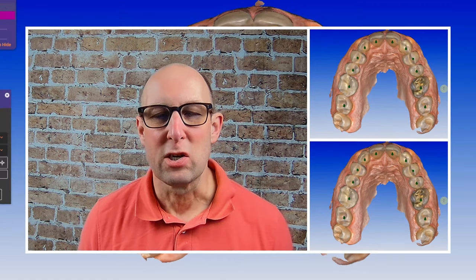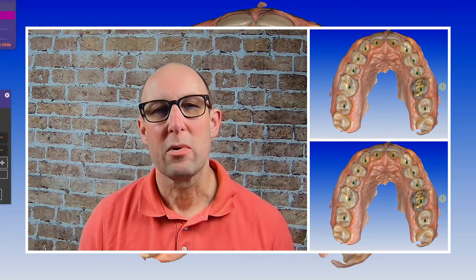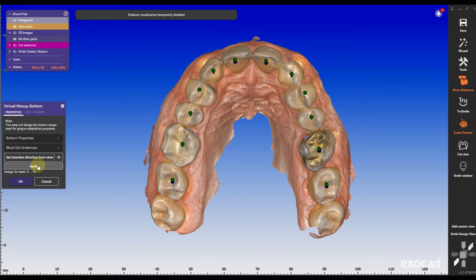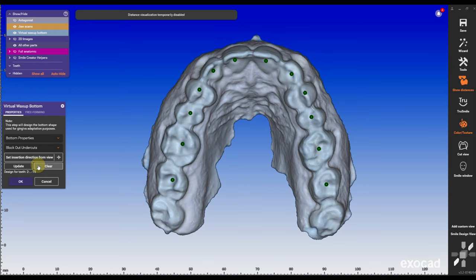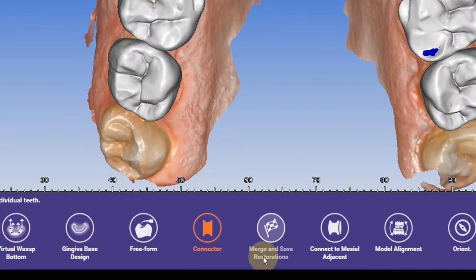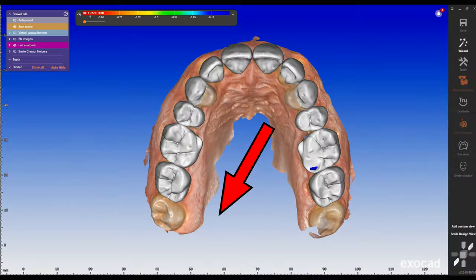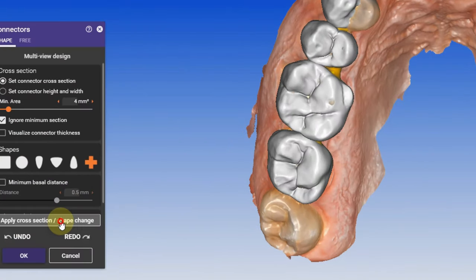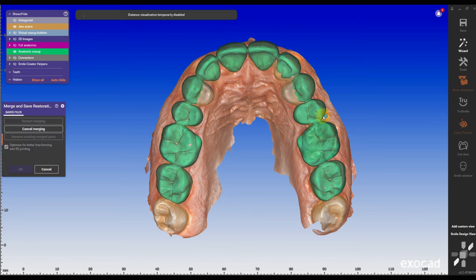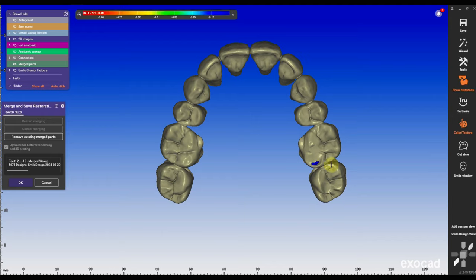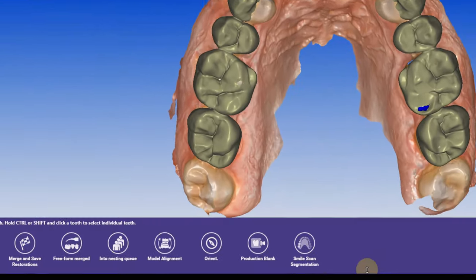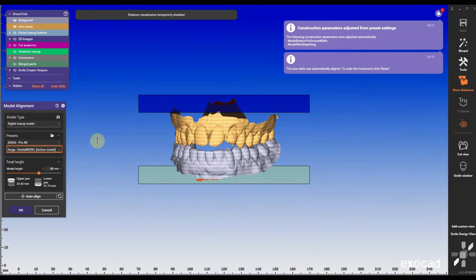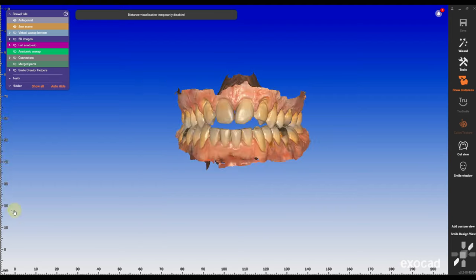Then I'm going to create the virtual wax-up. I'm going to move the teeth a little bit forward, hit apply, and the wax-up calculation is done. Under the connectors, I don't really build connectors — I just hit the plus sign to give it a minimum connection. After everything is merged, I can then move into the model builder step.